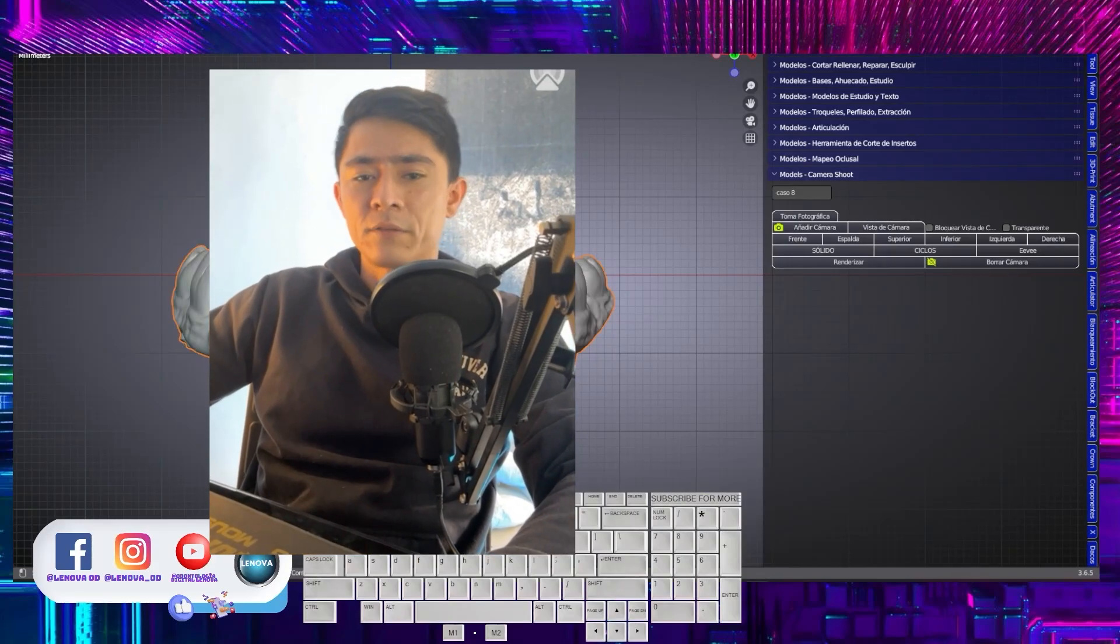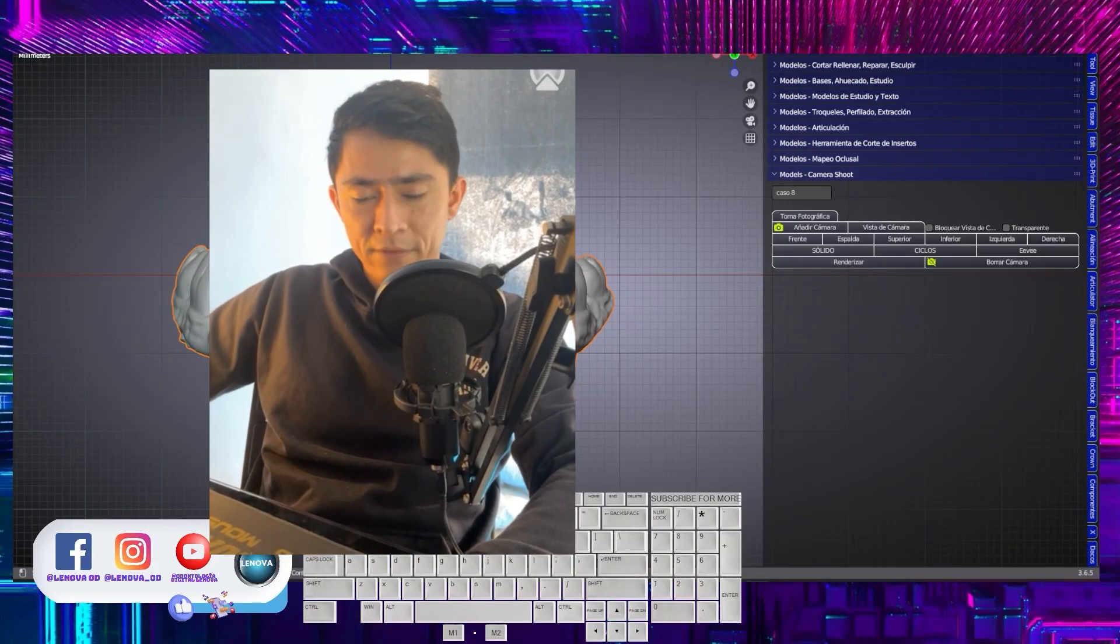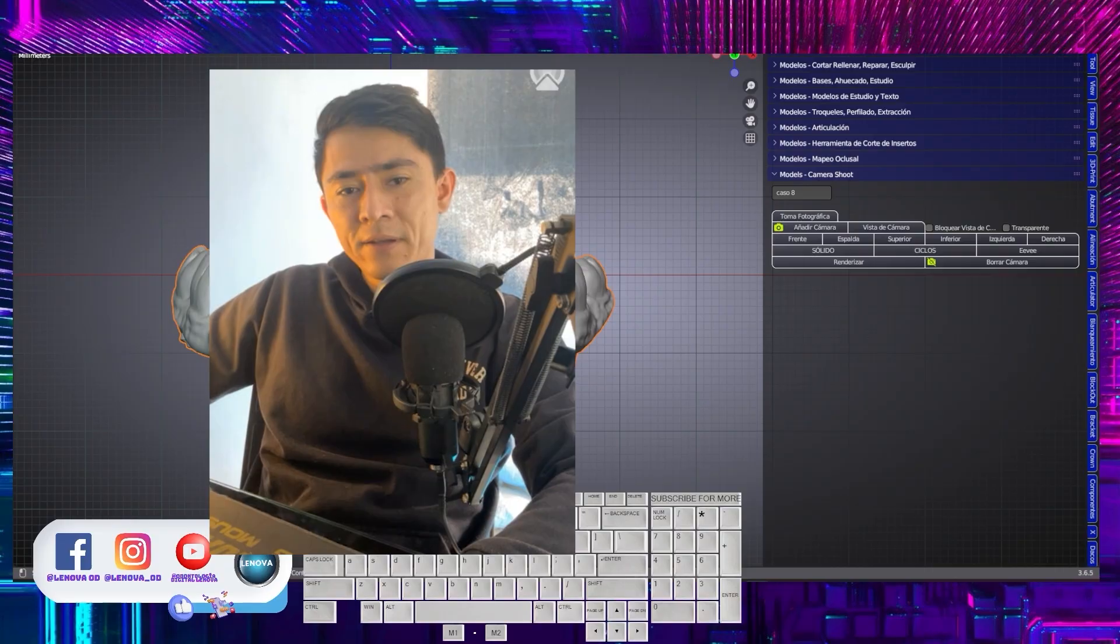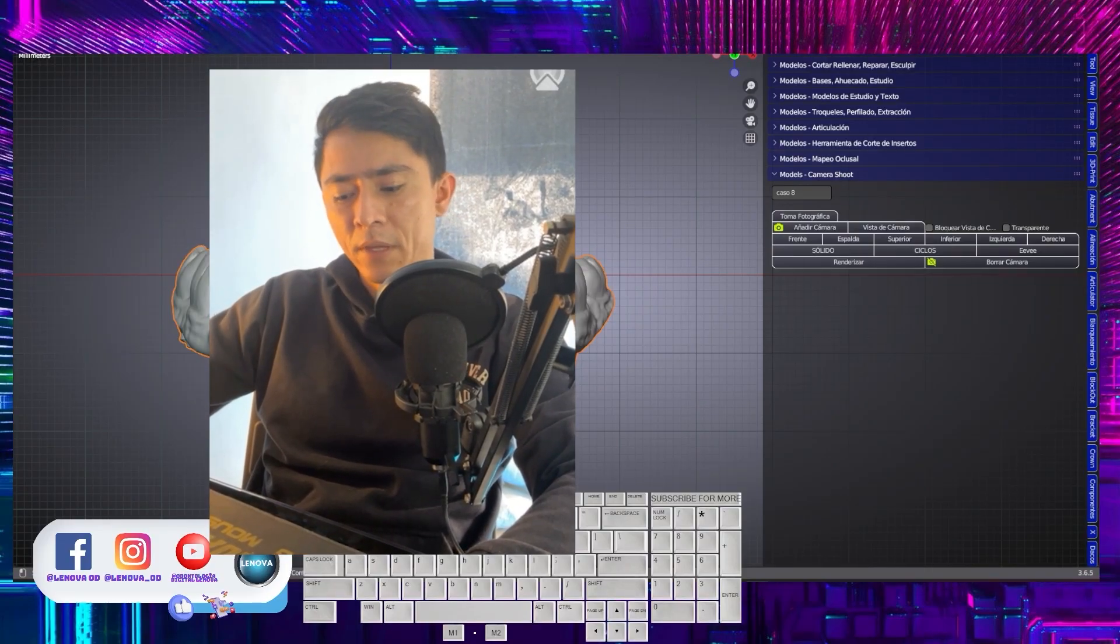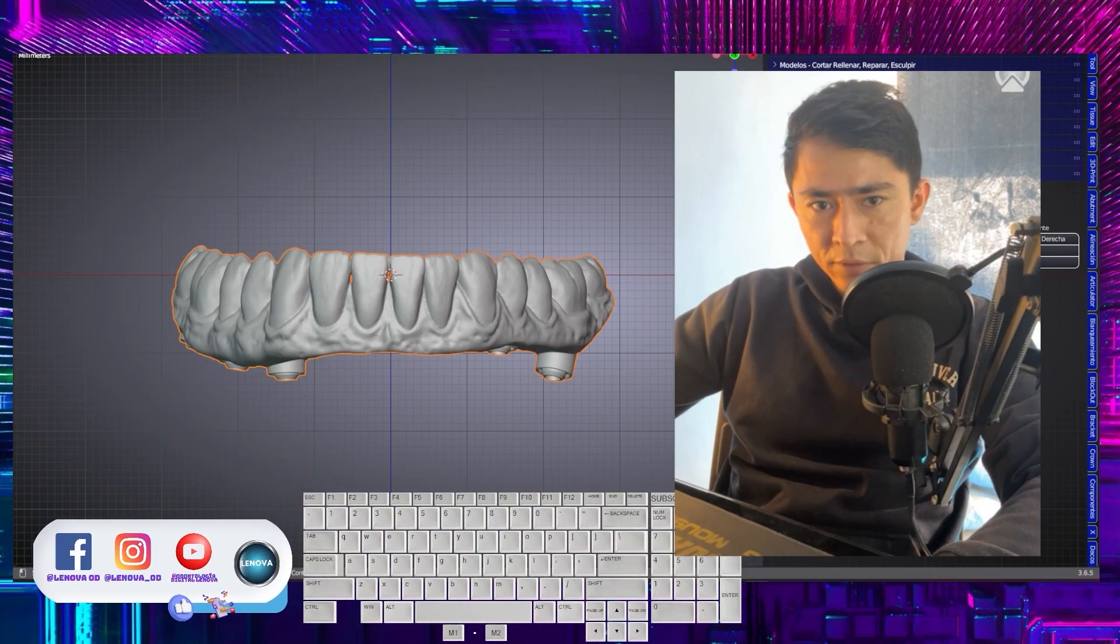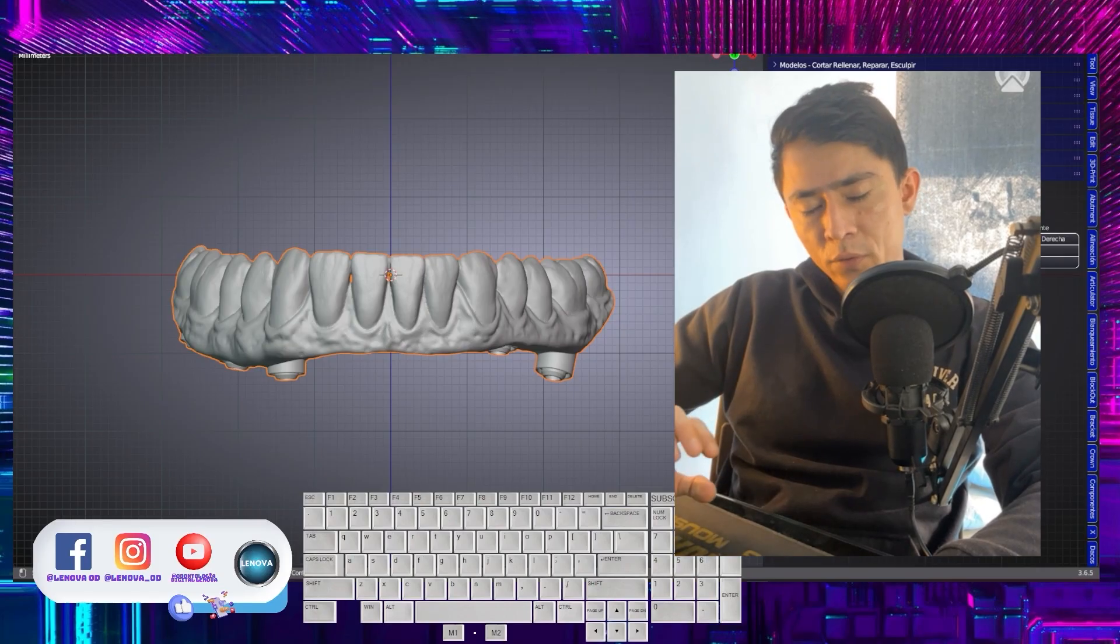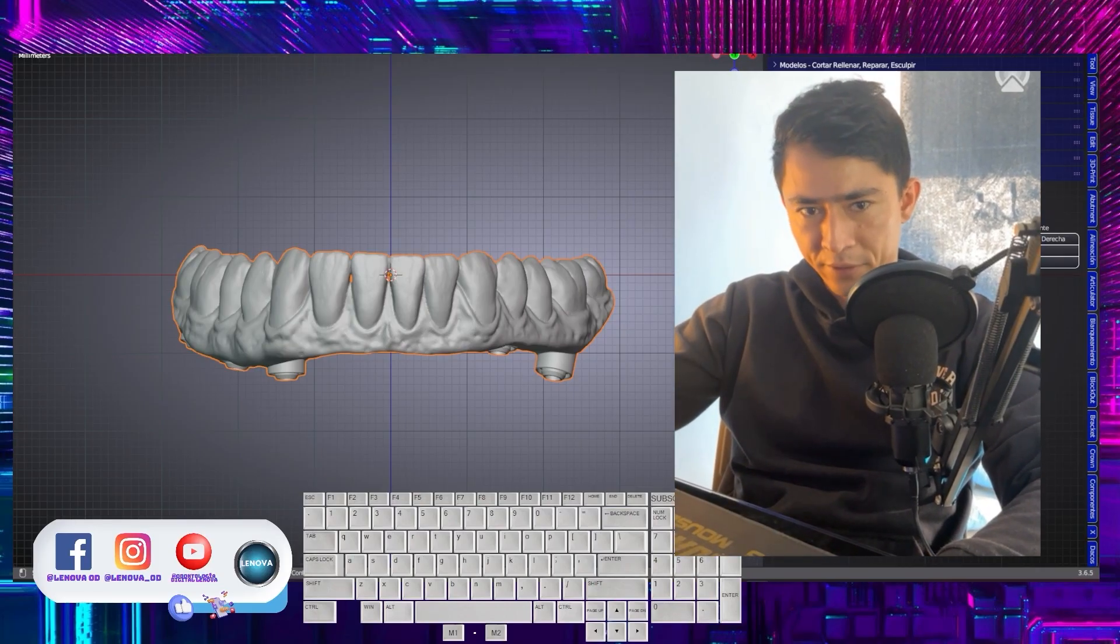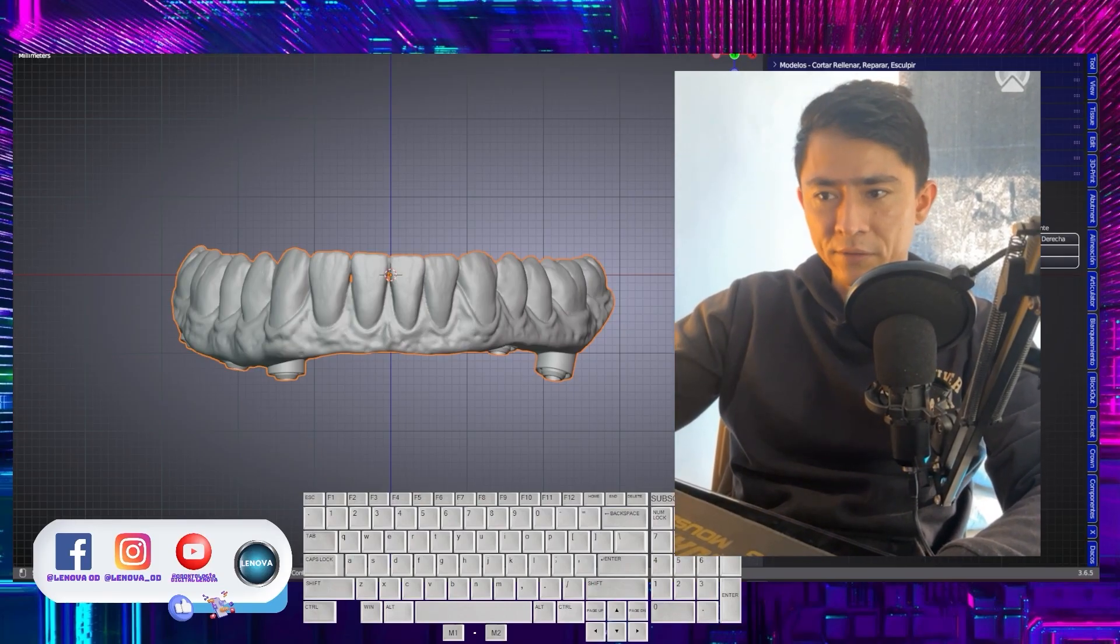Welcome everyone to this tutorial on the design of a hybrid bar using Blender for Dental software. In this tutorial, what we are going to address is the workflow for developing this type of hybrid prosthesis.